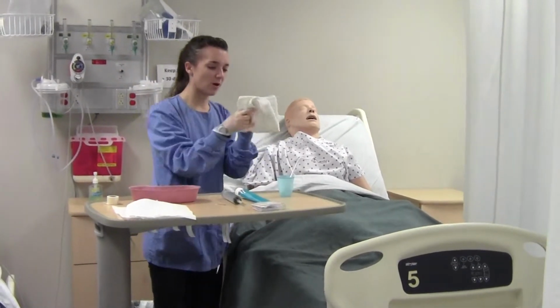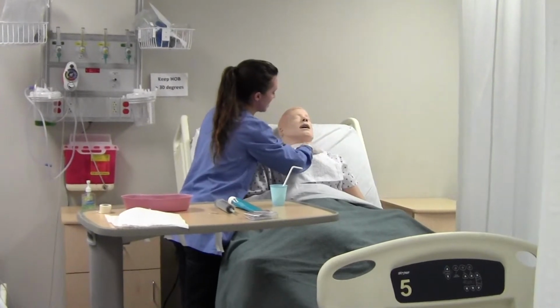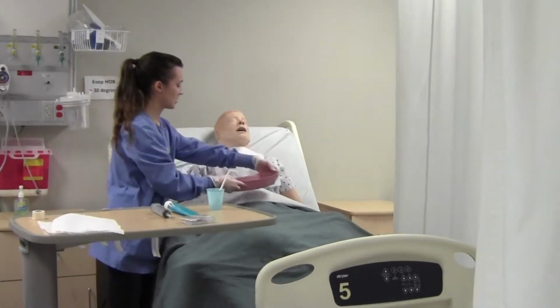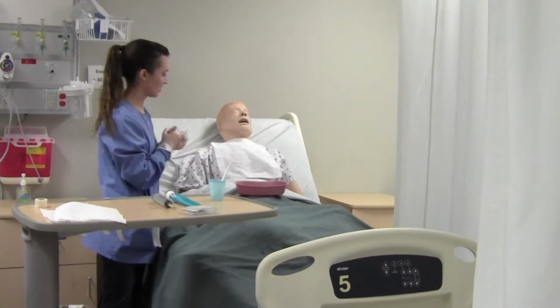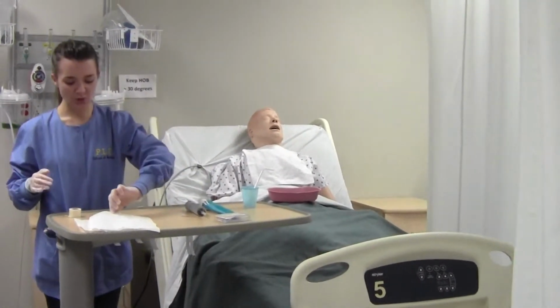Okay, so we're going to take our washcloth and we're going to put it on you to make sure that we don't spill anything we don't really want on you. Okay, we're going to put our emesis basin right here, just in case anything comes out. It's right there, or you feel like you have to cough or anything, it's right here. Okay, so we're going to open up our sterile tube.